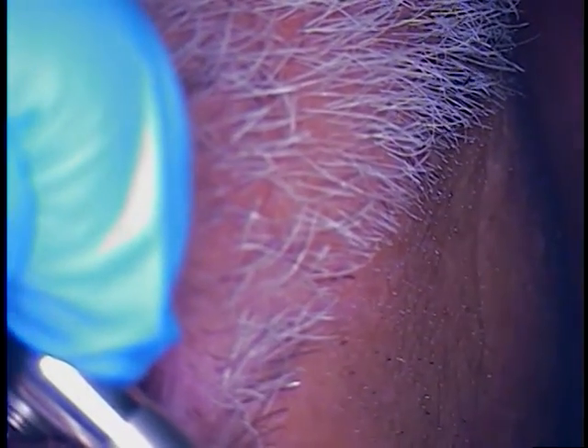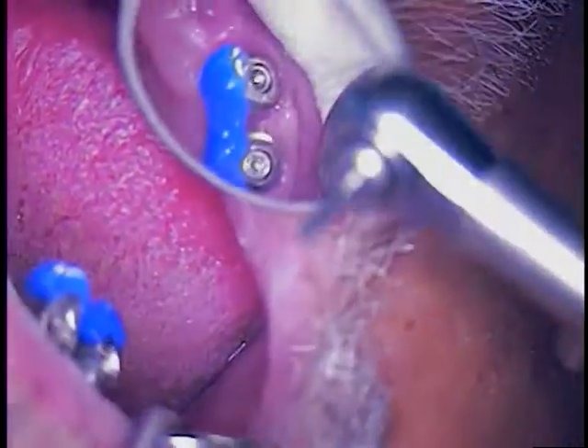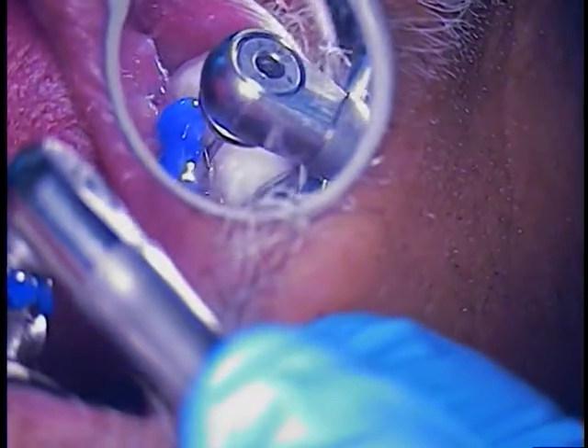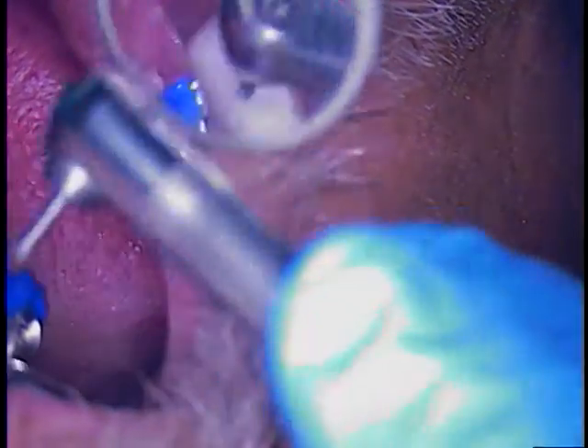Sometimes instead of stripping the head, I'm going to use a shorter driver — shorter shank — because I don't want as much torque to go through the shaft. I want to get it all going to the head of the screw. So shorter shank. Let's see if it does fit. Not quite, so I got a little limitation there. We'll have to use a longer driver.